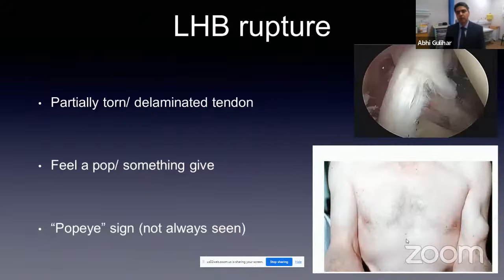The rupture of the biceps tendon is an extremely common condition. So the image on the right is an arthroscopic image of a patient who had biceps pain, positive biceps test, but normal MRI arthrogram and normal plain MRI. So we were told there's no problem with the MRI. We inserted a camera in the shoulder, and here we see that the biceps is literally hanging by a thread. So this was a degenerative tear of the biceps, which had been exacerbated by recent lifting.